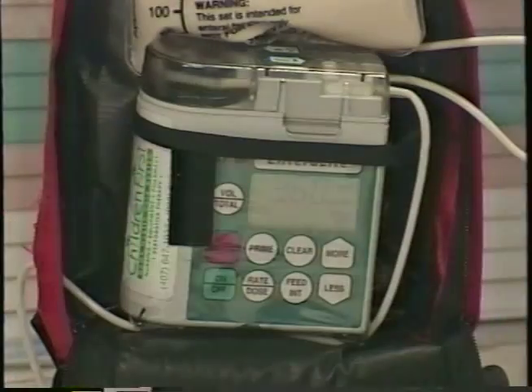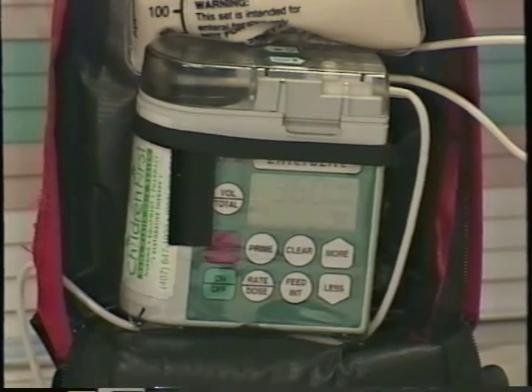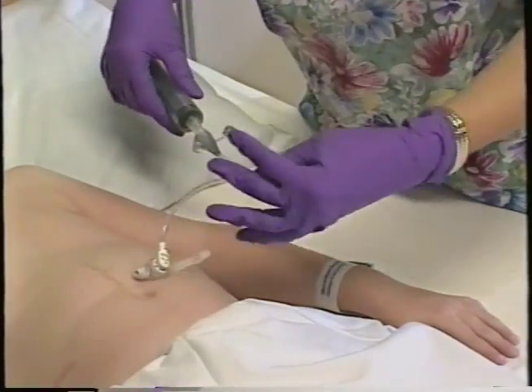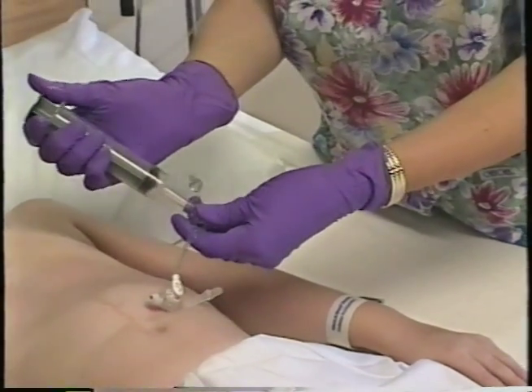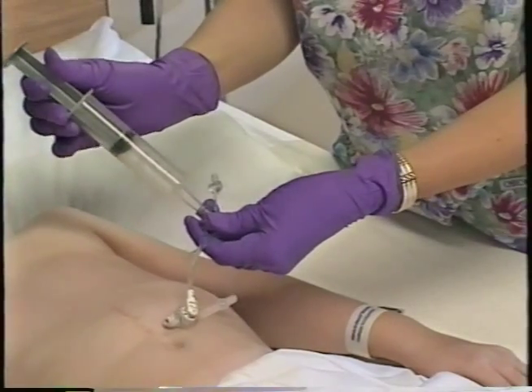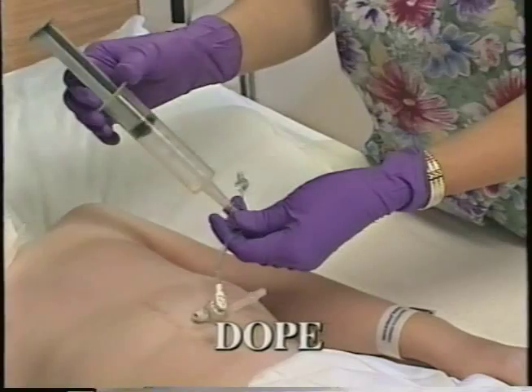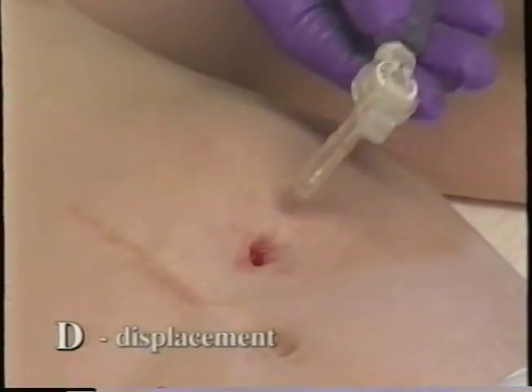In children with special healthcare needs, feeding catheters are often used to provide supplemental nutrition. There are many types of feeding catheters and tubes. Many gastrostomy tubes require an adapter to access the port and aspirate air from the stomach. Regardless of the type of feeding catheter a child has, identification of the cause of feeding catheter problems can utilize a slightly modified DOPE mnemonic.